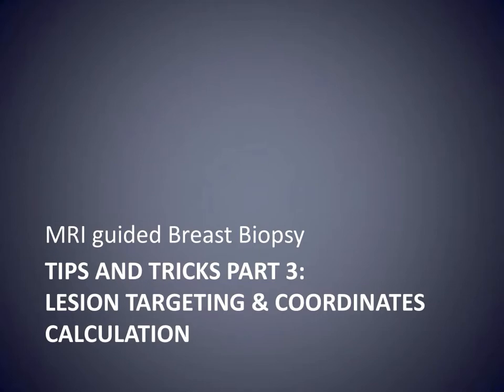The general concepts and approach presented in this video can be applied to various biopsy systems and devices. However, the exact screen display or thickness of the needle guide block can be different for different systems. So it's important for you to check the exact type of system and equipment that you're using at your institution.